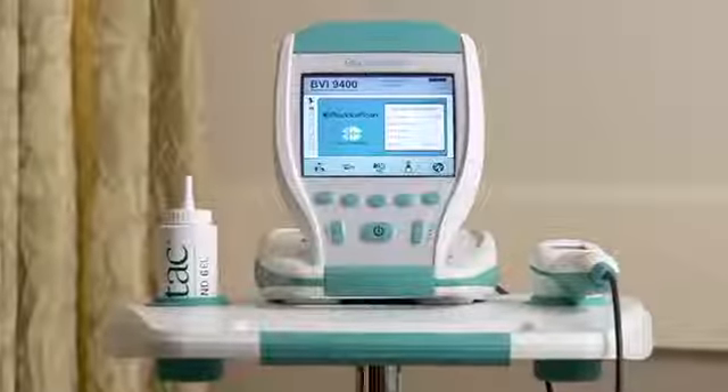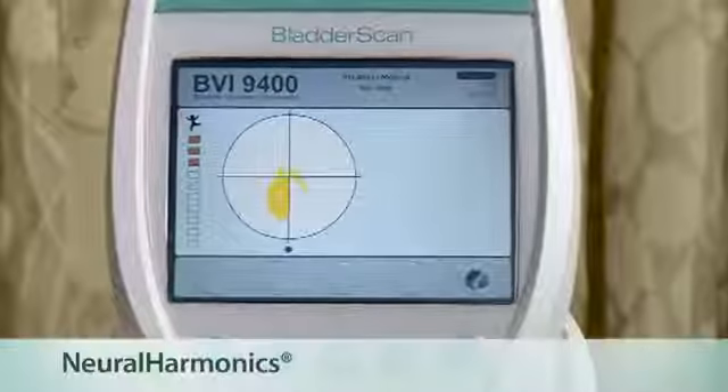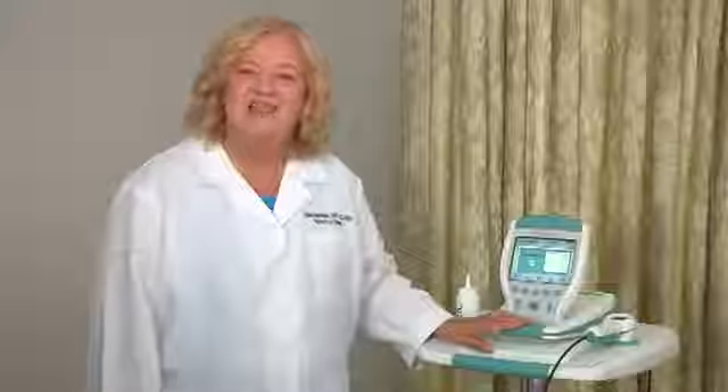Today, I want to introduce the Bladder Scan BVI9400, a bladder volume instrument with neuroharmonics technology. The Bladder Scan is a key instrument in acute care. It provides medical and nursing staff with accurate bladder volume without causing patient-related complications like pain and infection from unnecessary catheterizations.